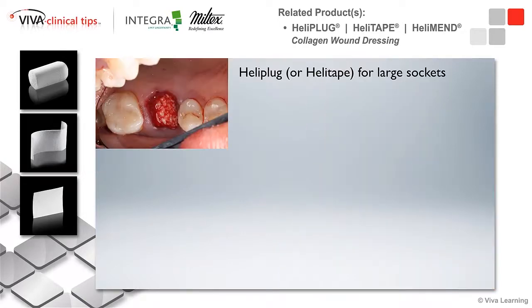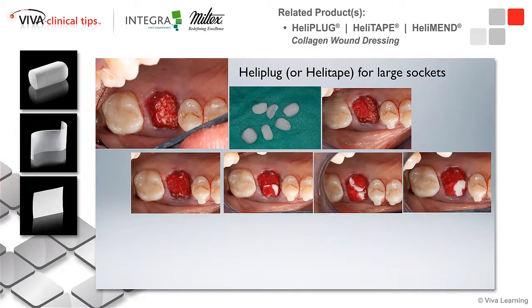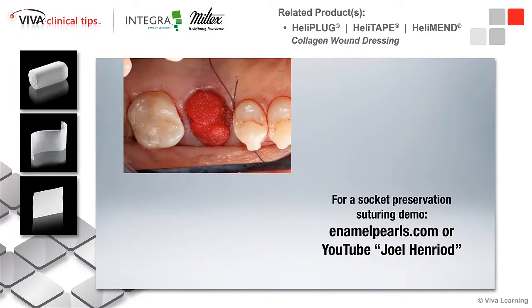If we have a large socket like this, you can still use HeliPLUG or HeliTAPE, and you can basically divide it up into pieces and cover over the socket. At the end, the same thing needs to happen, where we go ahead and we take our suture. We're going to go ahead and close over the top.